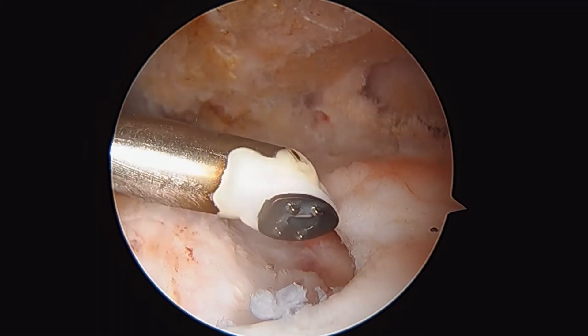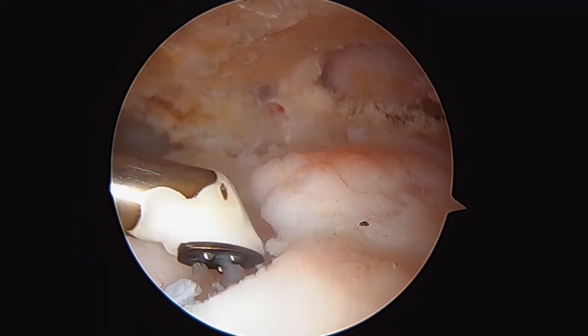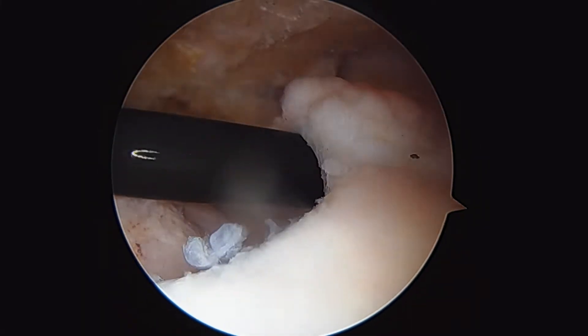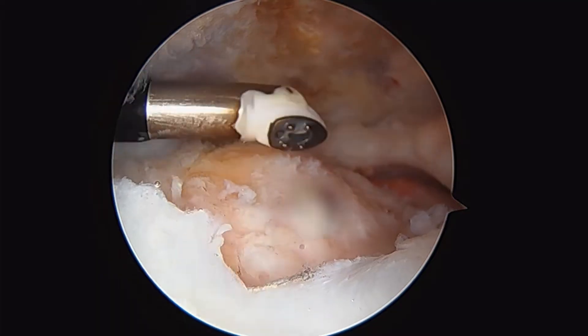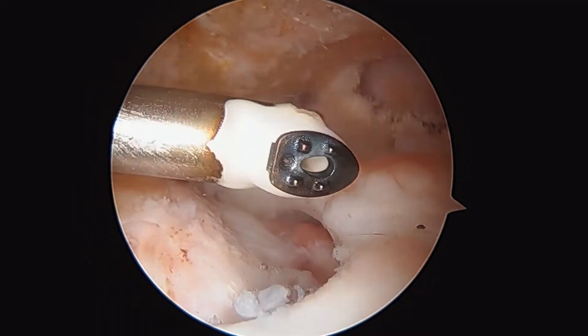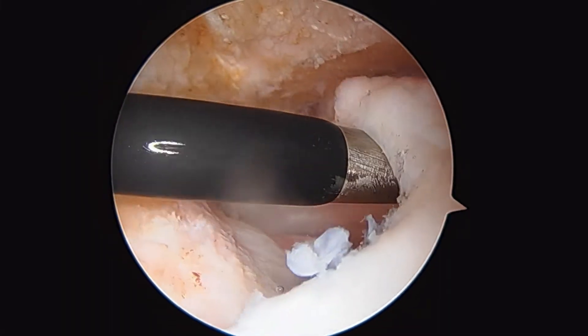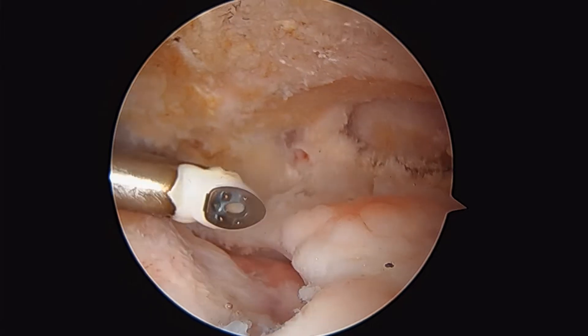You can see the sort of half circular shape here. This is the supraspinatus tendon. You can see me getting under it here and lifting it up. So this tendon was originally attached over here to the humerus, and it's pulled off the humerus and slowly starting to retract there medially. So this is a full thickness rotator cuff tear, which we are going to fix.